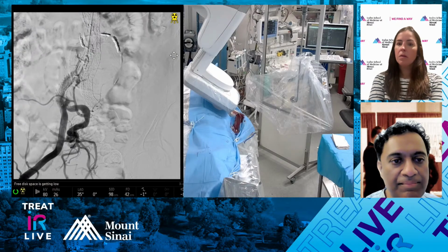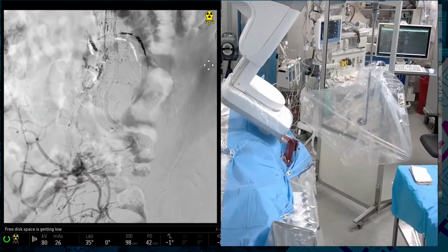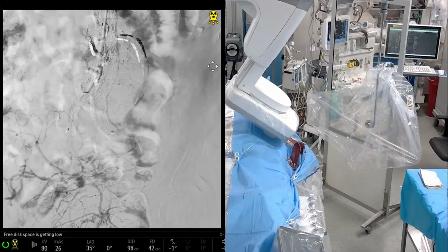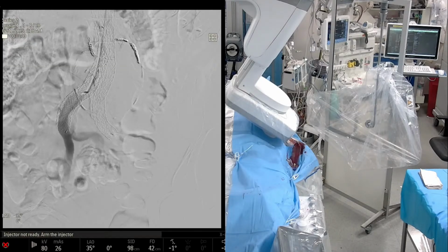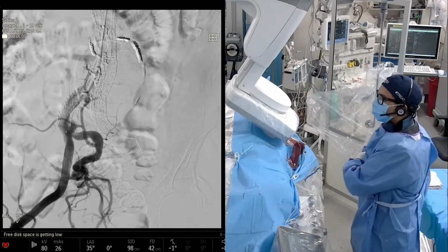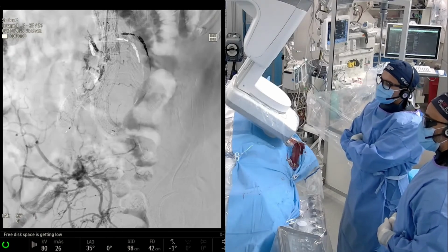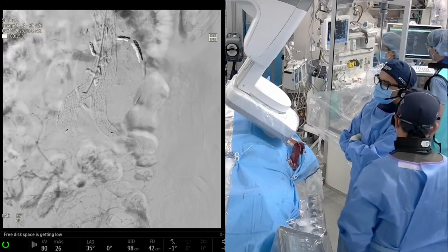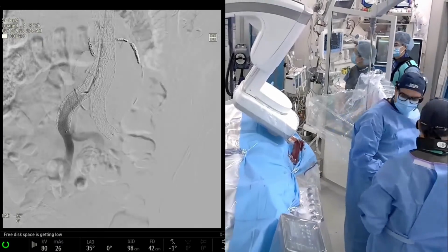Yeah. Oh, interesting. You can see the leak there, like it's coming up, but I don't see a leak into the sac itself, which, as I think Jojo was saying, you can stop. It ends up being like a ball valve, right? It's not open all the time, and it's like this slow leak. So his sac didn't have a rapid expansion. It's slowly growing, and this is clearly not sealed. We didn't show you what it looked like before, but when it was initially placed, it was well sealed at this end. So we have the Benson.